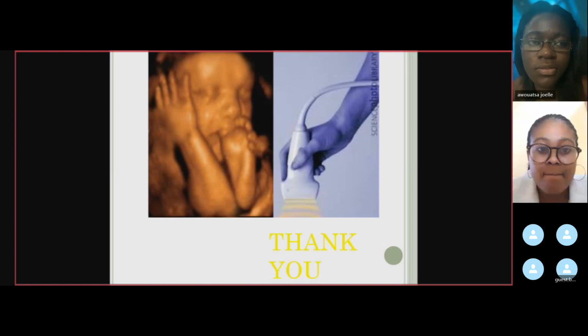So it is regulated that we should not use pulse wave Doppler for measuring the heartbeat of the baby, the fetus. We use the M mode to measure the heart rate. That is the reason we don't use a pulse mode, because of the bio effects of the ultrasound, which can cause harm to the fetus.